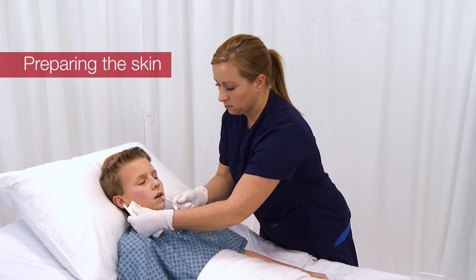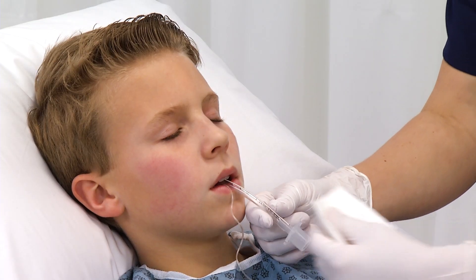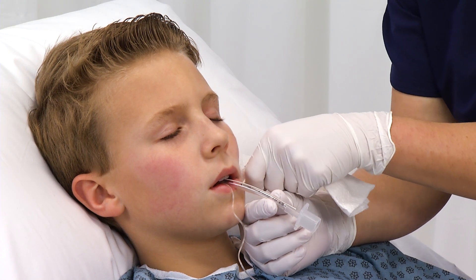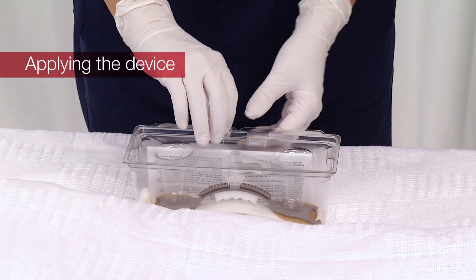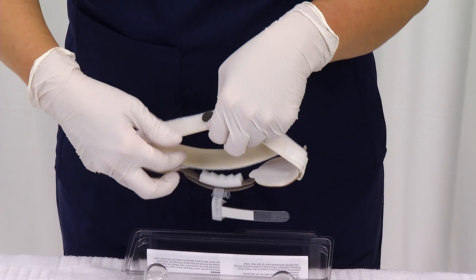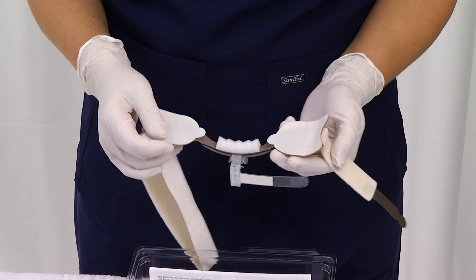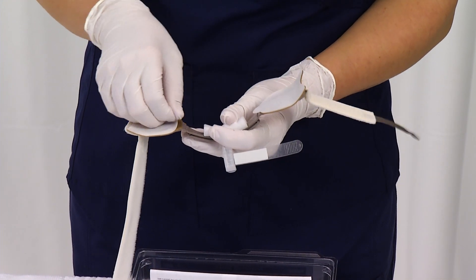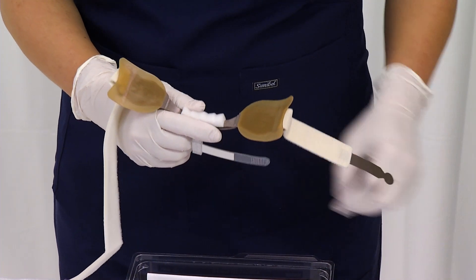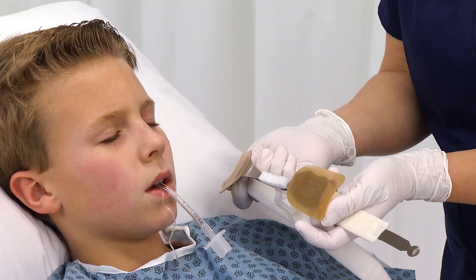Before applying the device, the patient's skin should be clean, dry, and free of oily residue. Do not use skin gel wipes or other skin preps with the Oral Endotracheal Tube Fastener. Remove the product from packaging. Separate the hook and loop closure — the gray tab on the neck strap. Remove the release liners from the two skin barrier pads. Pull back gently on the skin barrier pads so they are out of the way to prepare for application.